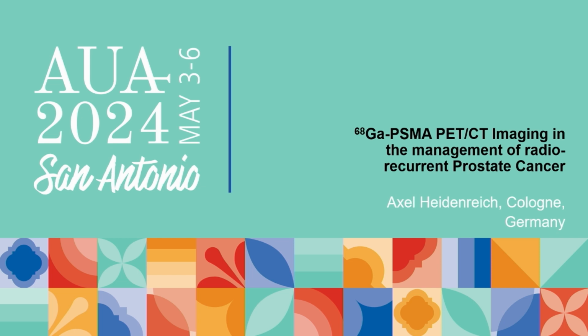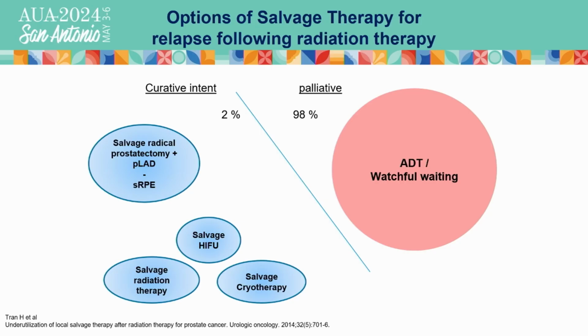So the role of PSMA PET scan in radiorecurrent disease for patients who have received radiation treatment to the prostate and who recur. The problem of all these patients is still, even nowadays, this is a study from 2014, but even today, most of the patients who relapse after radiation treatment locally receive androgen deprivation therapy. So we give systemic treatment, although there is only a local relapse, which could be treated locally with a secondary option, which will result in a high cure rate.